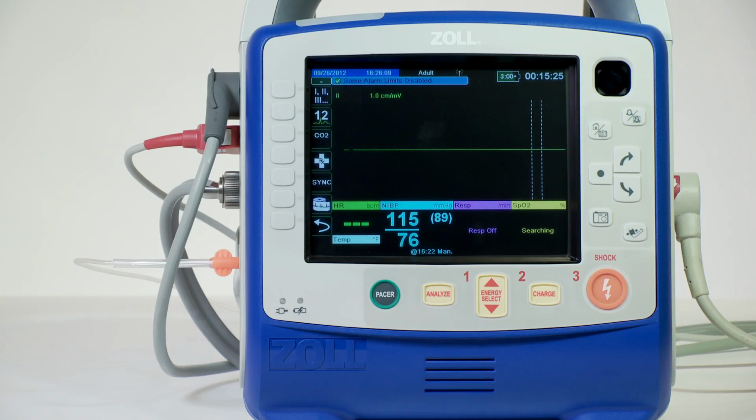If a standard nasal CO2 sampling cannula is used on such patients, the end-tidal CO2 values in the capnogram displayed will be substantially lower than the actual CO2 levels present in the patient's expired breath. Place the oral nasal cannula in the patient's nostrils and adjust the tubing comfortably around the ears.